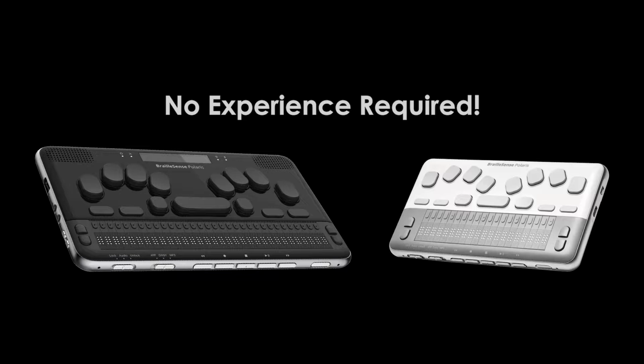Before jumping in, I'd like to point out there are multiple ways to change the Braille settings. Generally, I like to adjust settings using the fewest keystrokes possible so that it takes the least amount of time. In this video, I'll cover changing the settings in the most efficient way possible, then follow it up with an alternative way of changing the settings. I cover both so you can use the approach that you are most comfortable with.